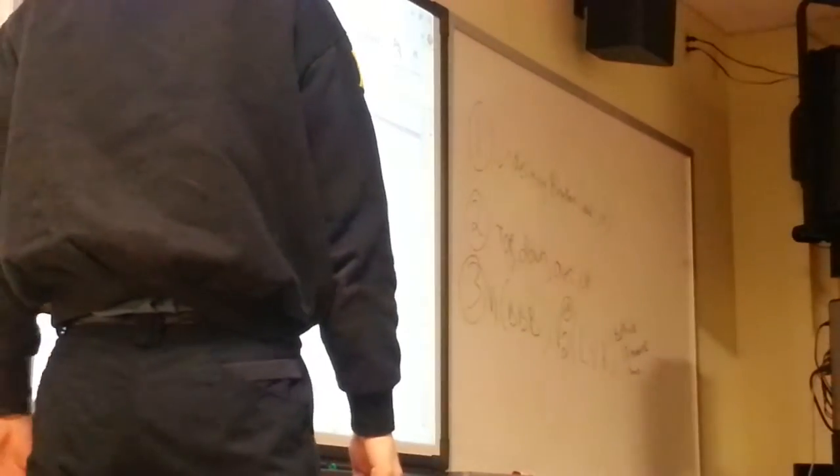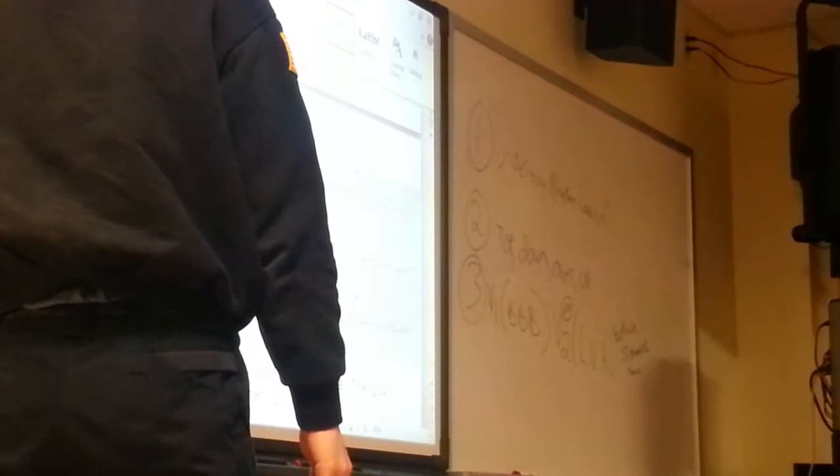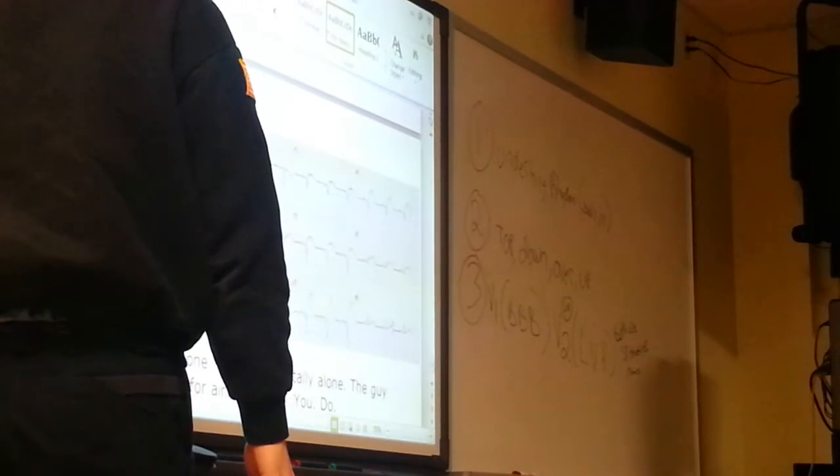All right, show me lead one. There's a P-wave, there's a QRS, and that's not normal at all. Could you be more specific? The T-wave is humongous. The T-wave is totally standalone. Can you turn sideways? Absolutely. It looks funky, but what did we say? That might just be looking funky. They do, for us. Move to the other side of the board, because we're not used to looking at it. Okay. Show me lead two.